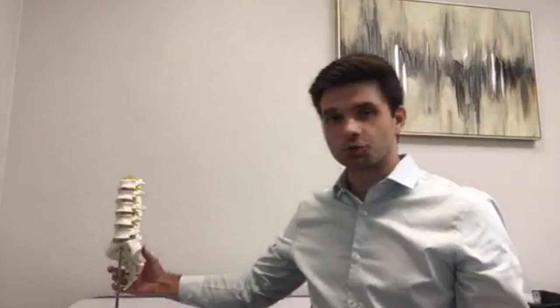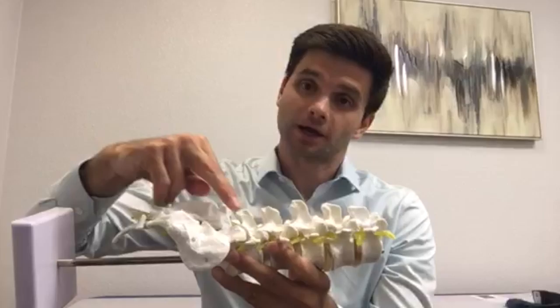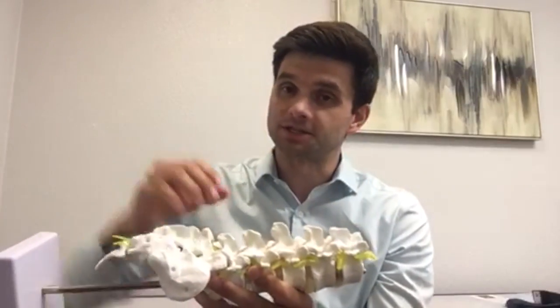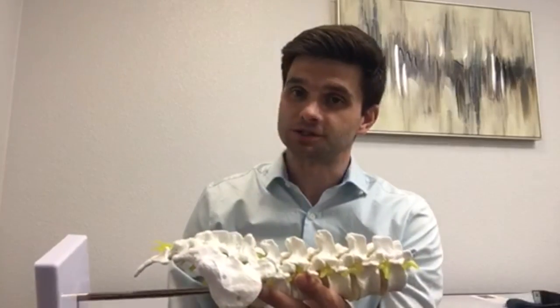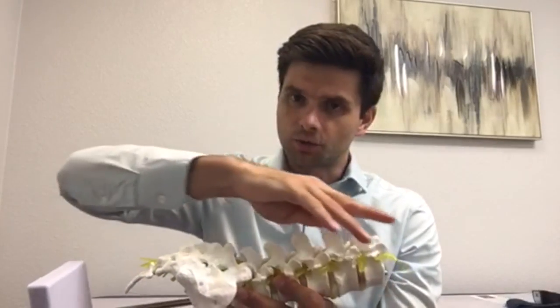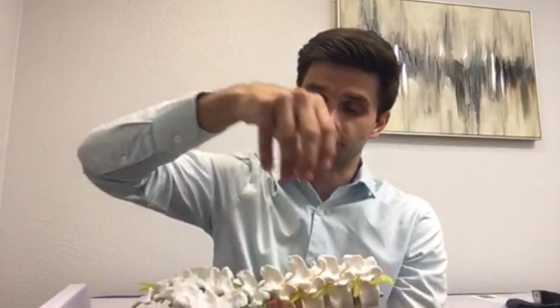Today I want to take a few minutes to talk about one of the more advanced interventional pain procedures that I offer called spinal cord stimulation. The way that spinal cord stimulation works is we place electrodes in something called the epidural space. The epidural space is the space within the spinal canal that's on the outside of the fibrous sac where the spinal cord and nerve roots run. With these electrodes in place, we can induce a small current over the spinal cord that modulates the way that chronic pain signals are sent from the periphery and then interpreted from the spinal cord going to the brain.